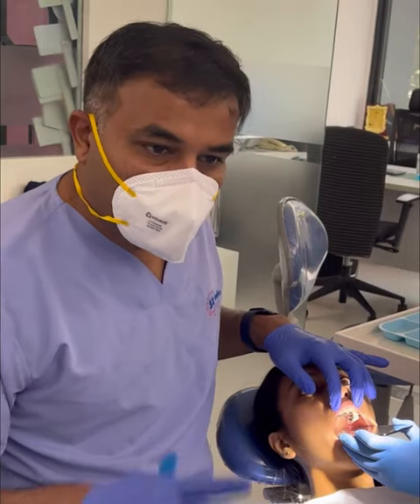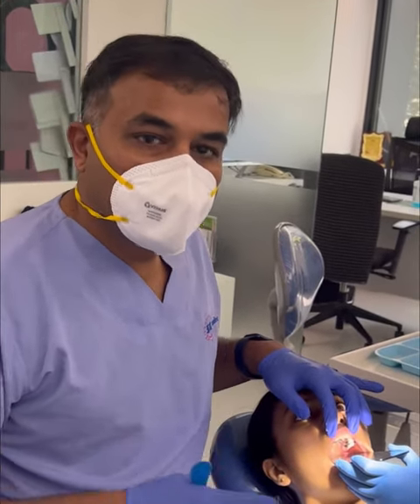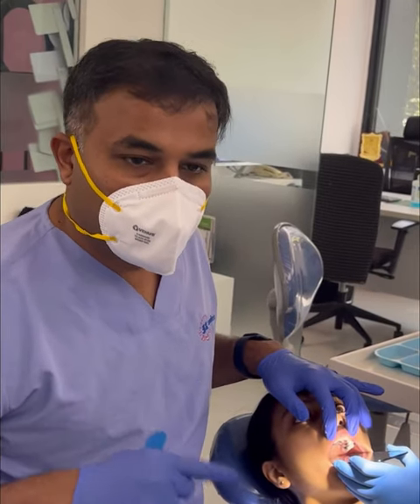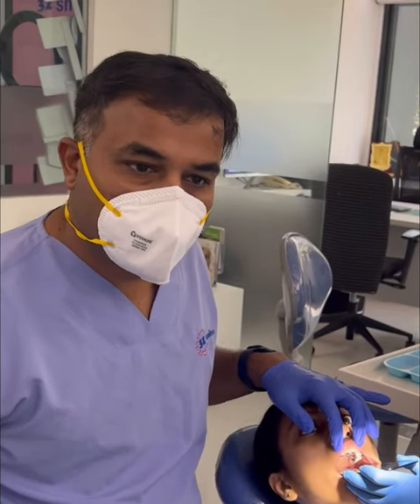We recommend a minimum of 20 turns and a maximum of 30 turns, depending on the type of expansion required and the case. It is very important that the patient does a follow-up with us every 10 turns. Sometimes we call the patient after 5 turns as well — whatever the doctor prescribes, we need to follow it.